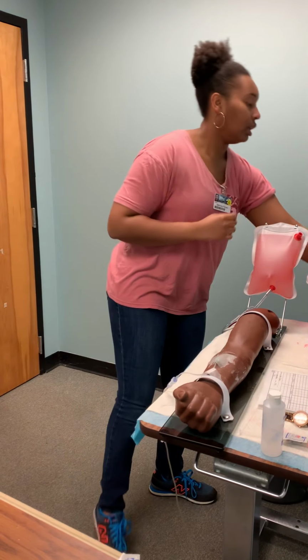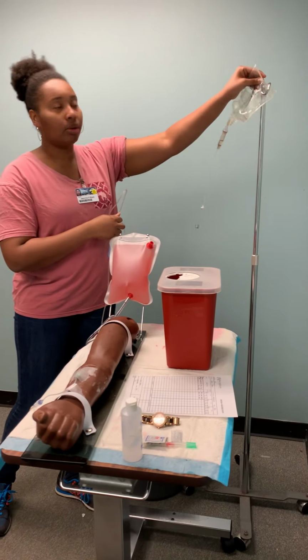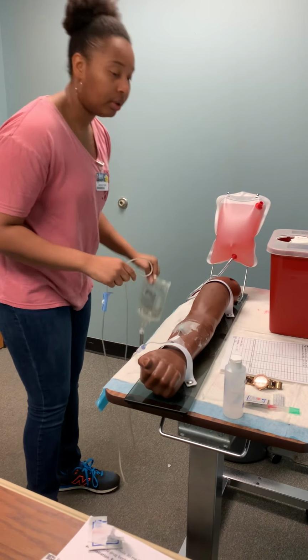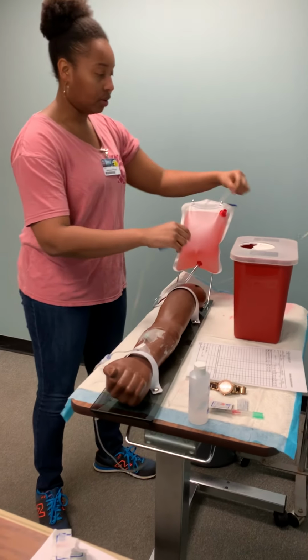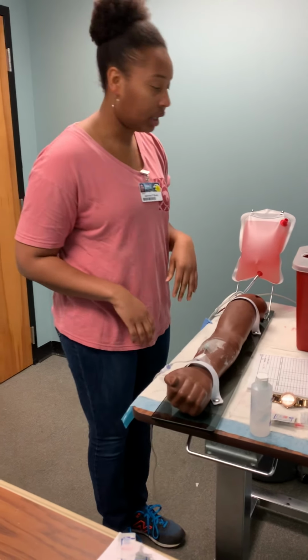So next I would check to make sure that I see blood return, making sure that the IV site is patent. I will lower it. Check to make sure that it is not swollen, that there's no redness, no pain. The patient states that there is no pain and she is comfortable.